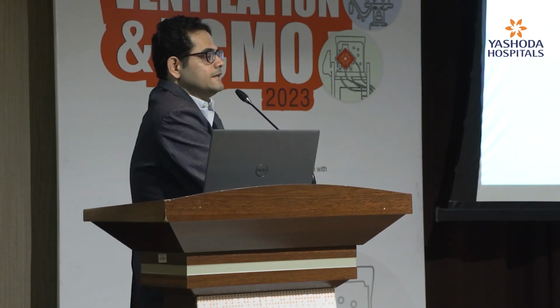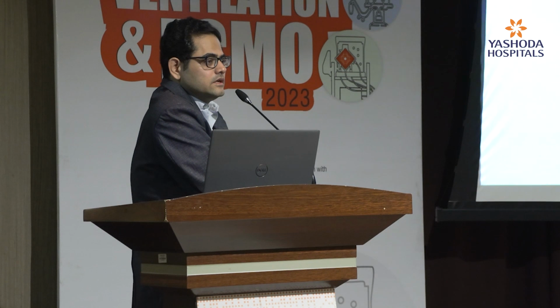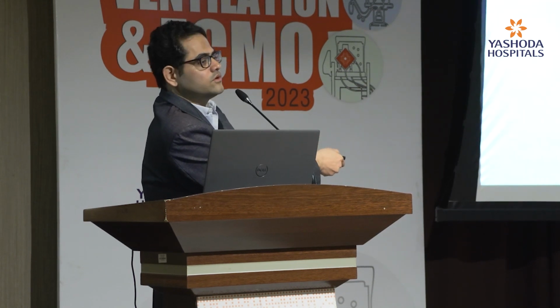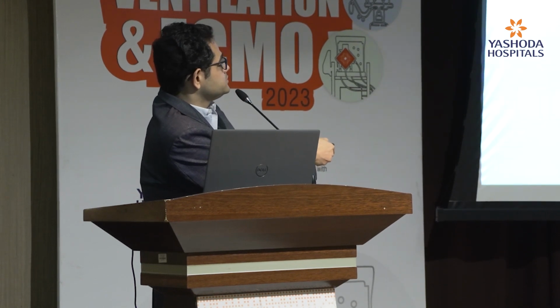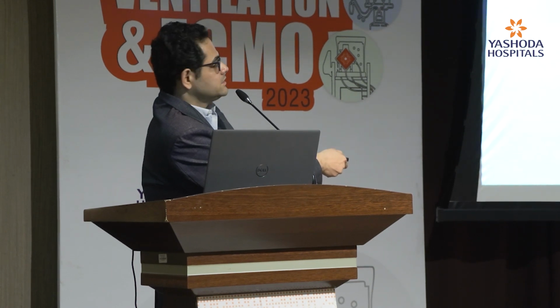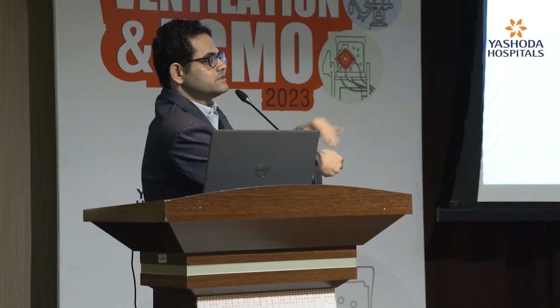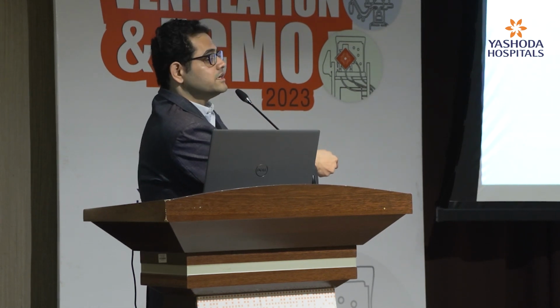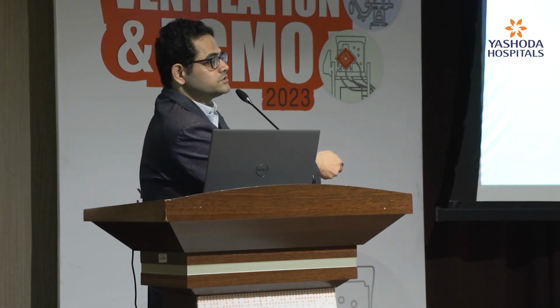What is this ventilator? So you see, this is volume targeted. Whatever the pressures are, as they increase, the volume will be the same. Okay, this is the pressure volume loop in volume control ventilation. So the compliance is dropping, the volumes are same, but the pressures are increasing. Okay, this is how you see it in poor compliance. That volume will be delivered, but the pressure may increase. Same thing in pressure targeted, pressure control ventilation: volume may decrease, but the pressure will remain the same. These are the information given by the pressure volume loops.